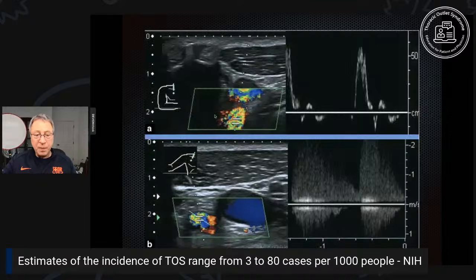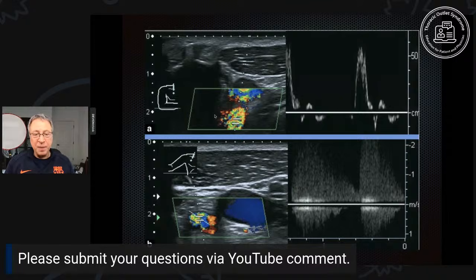It's very useful. So there's two pictures here, one at the top above the purple line and one at the bottom. And they both measure the same thing. They're measuring the axillary artery, which occurs right after the subclavian artery. It's between the rib and the clavicle. That's the subclavian artery. And then the axillary artery occurs. On the top, you'll see the top picture to the right. There's a little waveform. Looks like a sonar that you see in war movies when they're showing a submarine using its sonar. The bottom picture, below the purple line, you'll see to the right, these big gray triangular shapes.